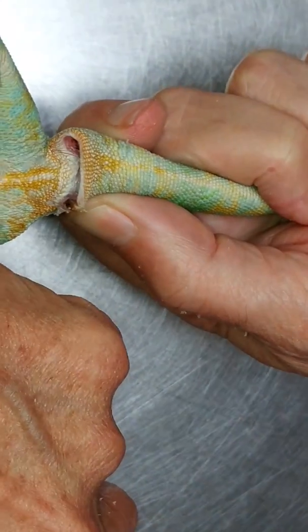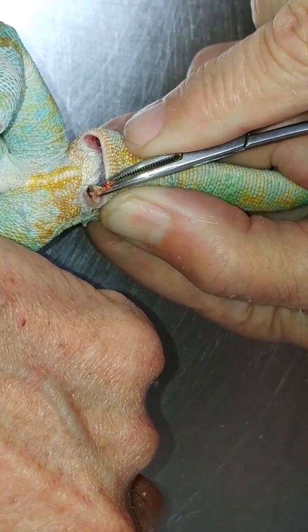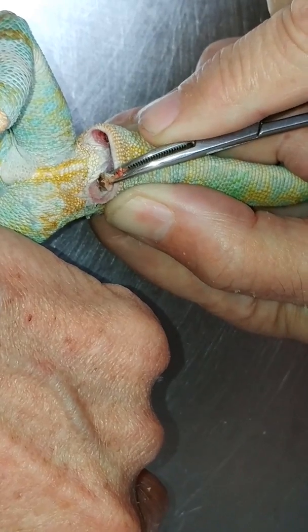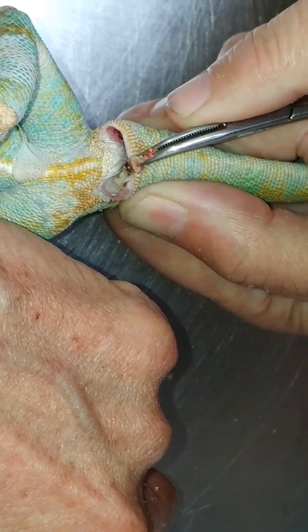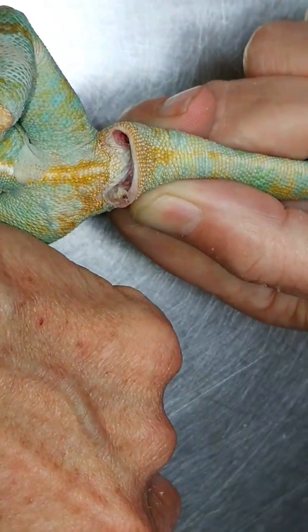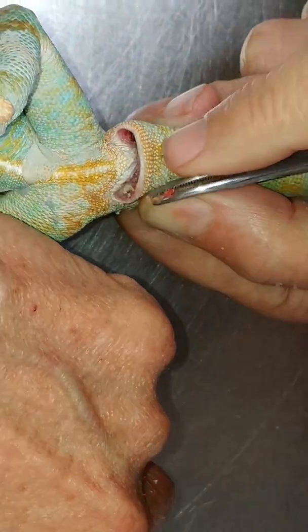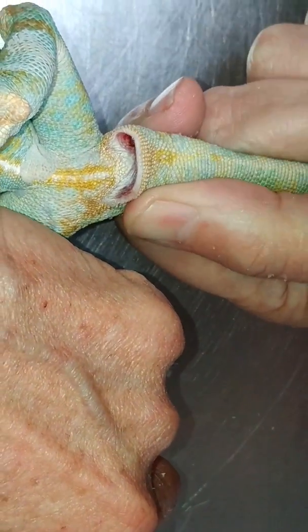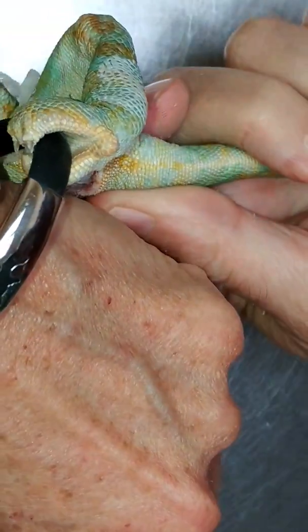See if I can help that other side along a little bit. You can see how big these things can get. We see them more often in the iguanids than the chameleons. See, that's dropped back down in there — I'm not going to go fishing for that one.